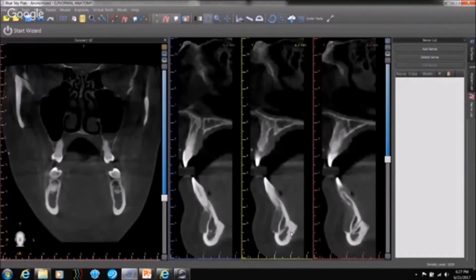One of the easiest ways to understand the cancellous bone, the cortical bone, the bone marrow spaces, and any kind of osteoarthritic changes, is to check their drug history.